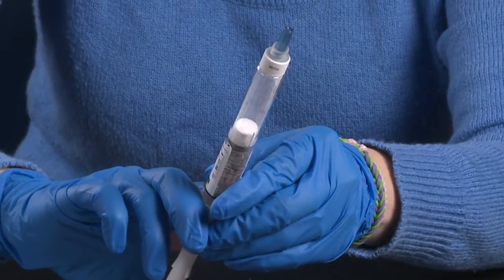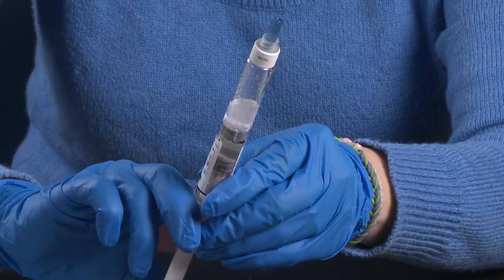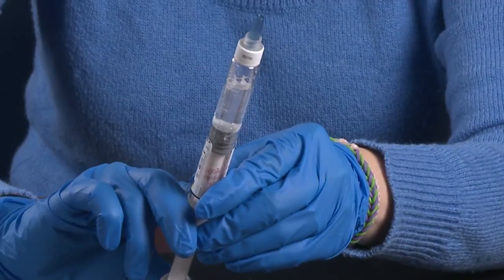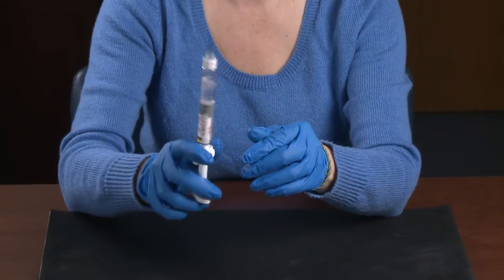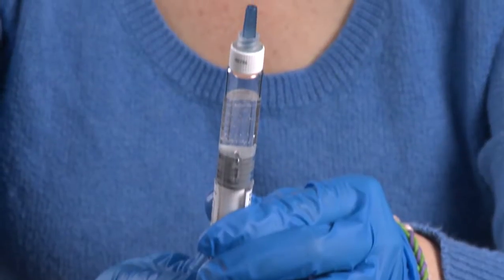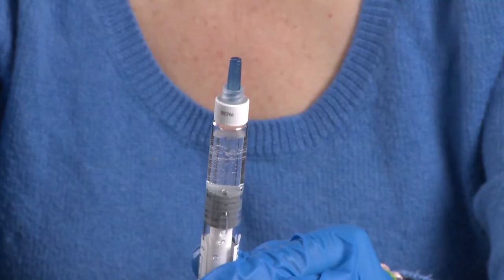Gently and slowly push the plunger until the two stoppers inside the syringe meet and the liquid has all been transferred to the chamber with the factor powder. With the SoloFuse syringe upright, gently swirl until all the powder is dissolved, and then slowly advance the plunger until almost all of the air is removed from the syringe.